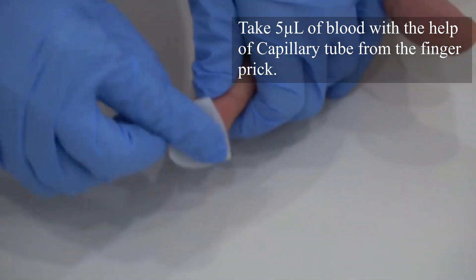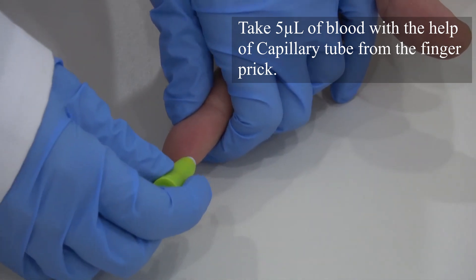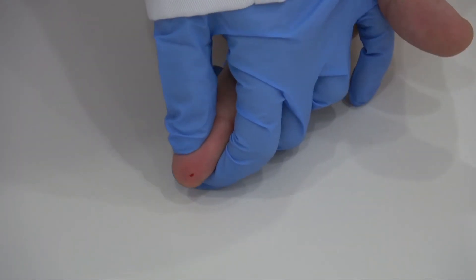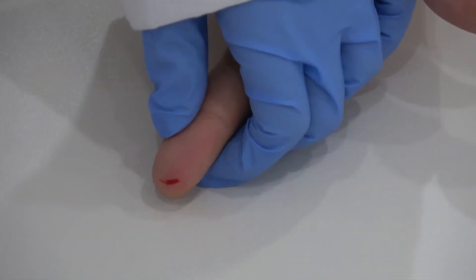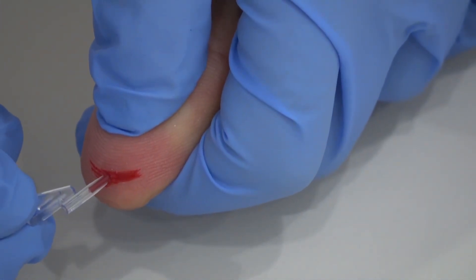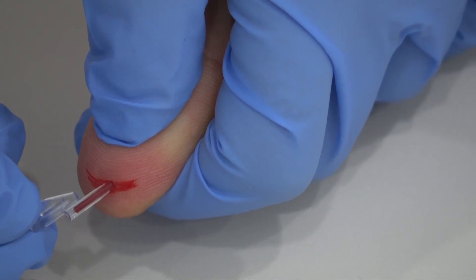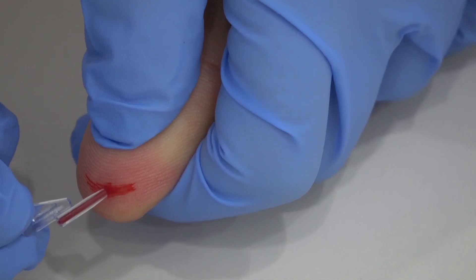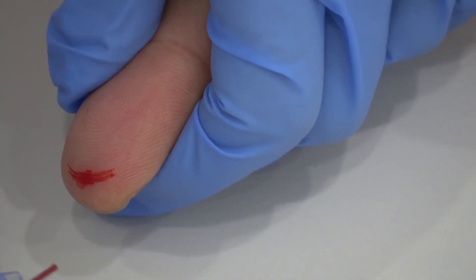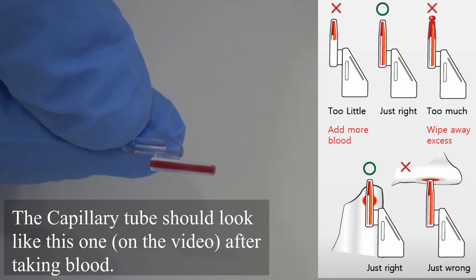Take 5 microliters of blood with the help of a capillary tube from the finger prick. The capillary tube should look like the one you can see on the video after taking blood.